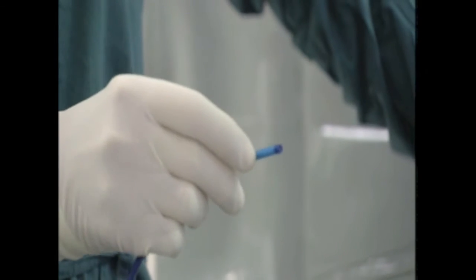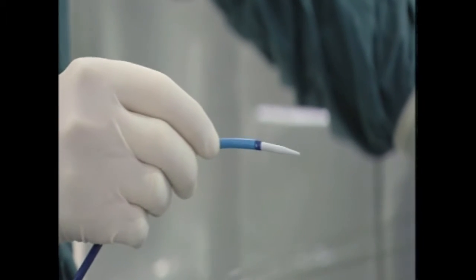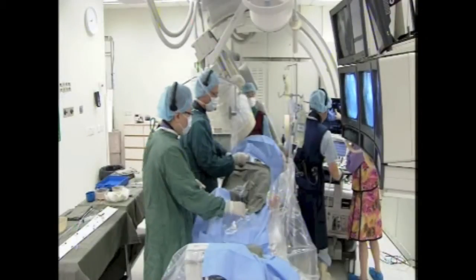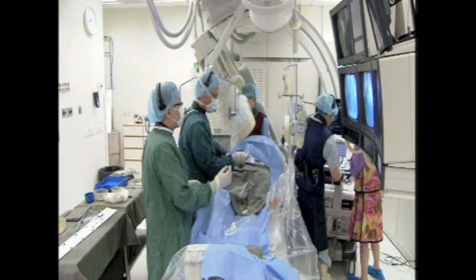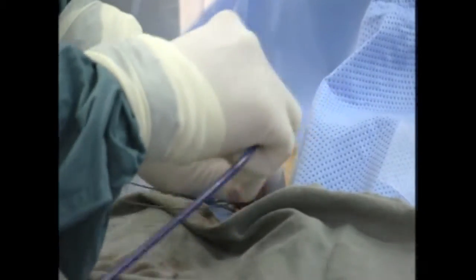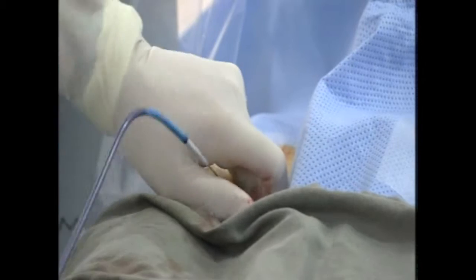Dr. Sievert, can you just explain where the optimal point of transseptal puncture is for this particular case? Yeah, usually we puncture inferiorly and posteriorly, but I must admit it's very hard to predict what the best puncture site is, because it depends upon the orientation of the appendage and the relationship of the appendage to the septum, and this is really variable.